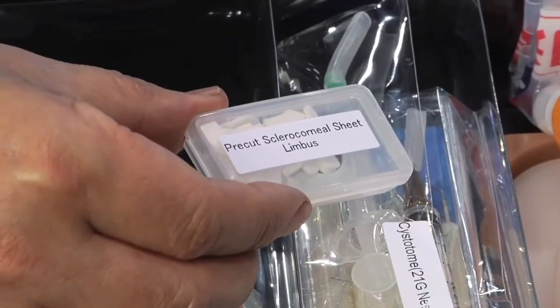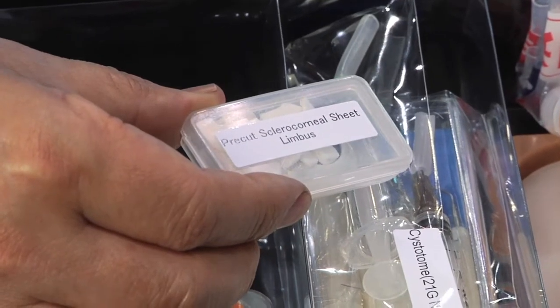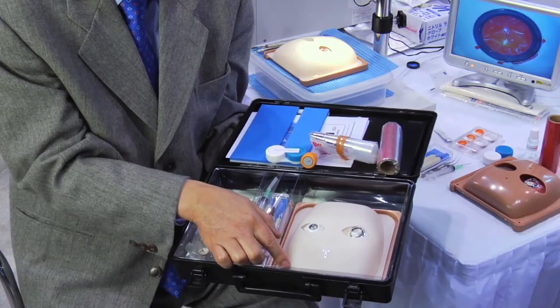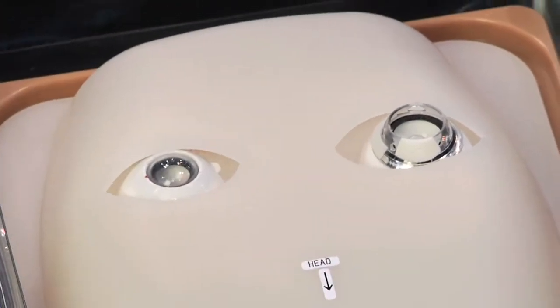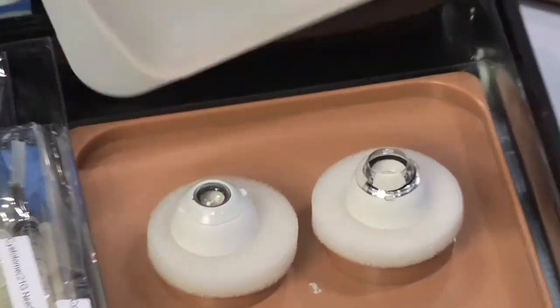The pre-cut sclerocorneal sheets attach to the cornea for practicing limbal incisions. The Kataro face mask has two eyes — one a deep-set eye and the other the normal depth. When you lift up the face, you can actually see how the Kataro works.